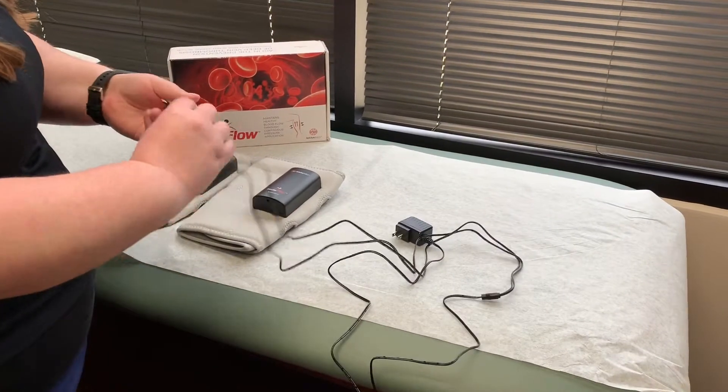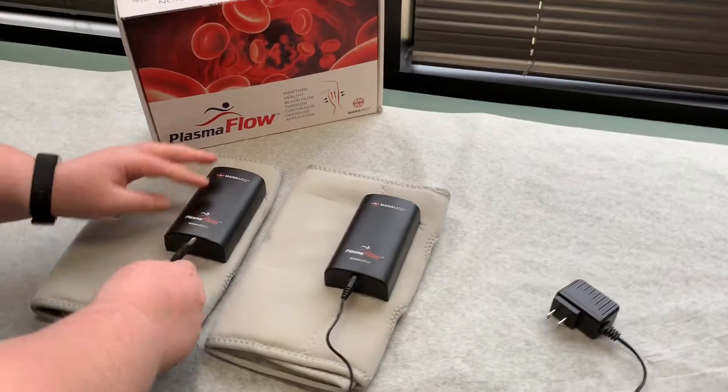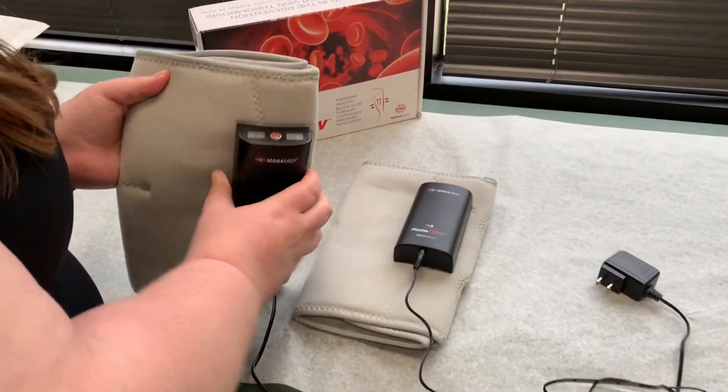Once you open it up, you're gonna want to charge this for at least three hours. These just go right into the ports here, and then you turn them on here with the power buttons.